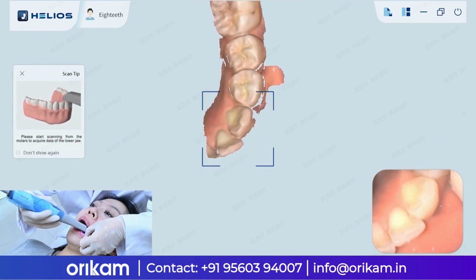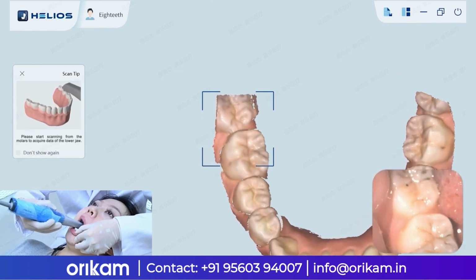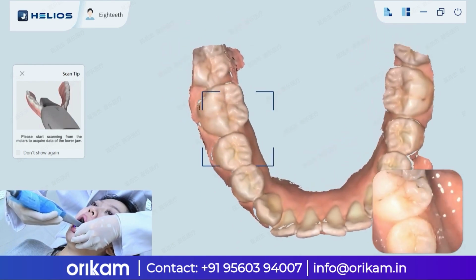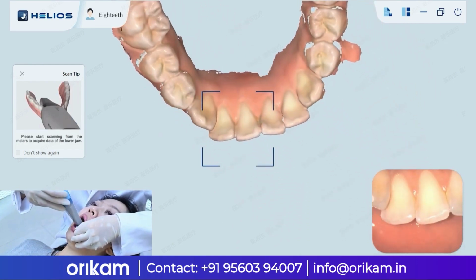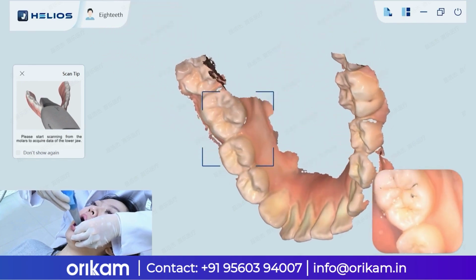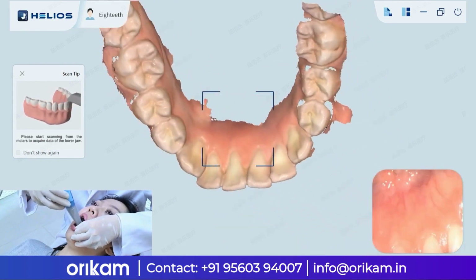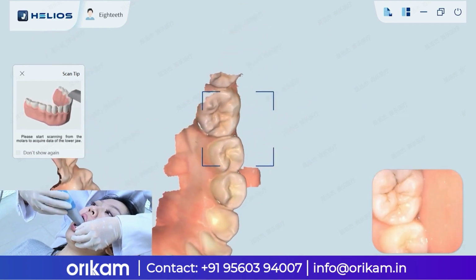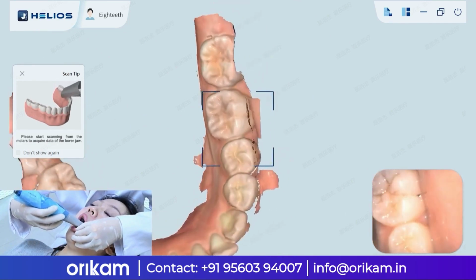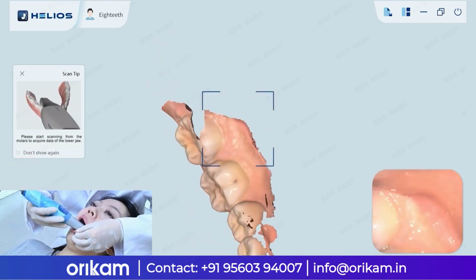Start from the occlusal surface of the posterior teeth and move according to the shape of the arch. When scanning the posterior section, transition to the lingual side, being careful to avoid the tongue. When starting the buccal side scan, begin from the occlusal surface and move forward.